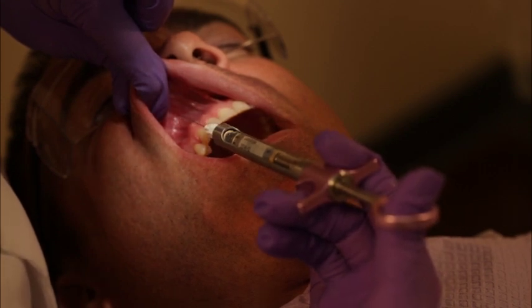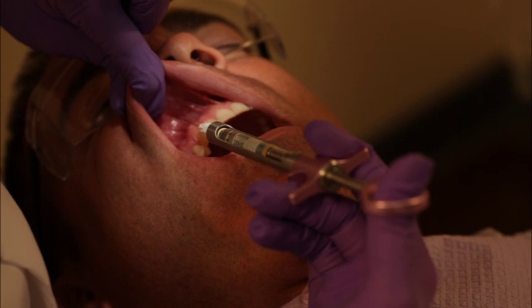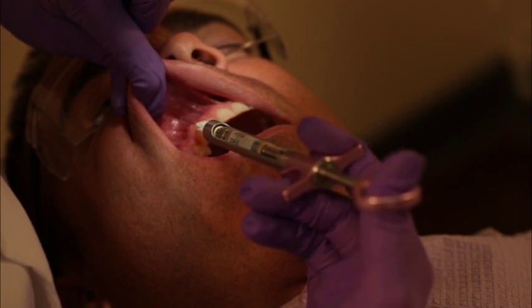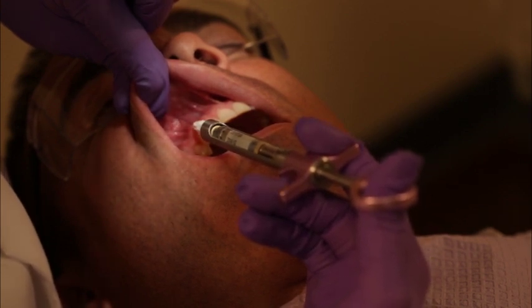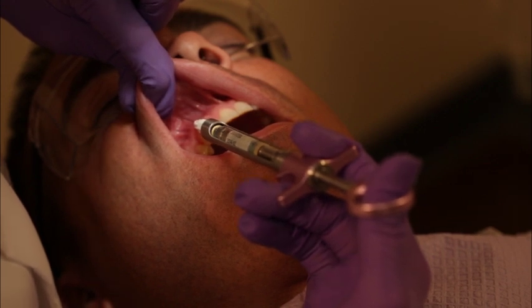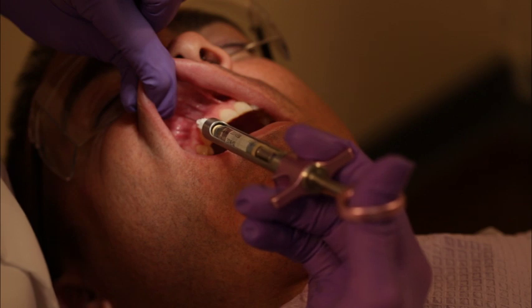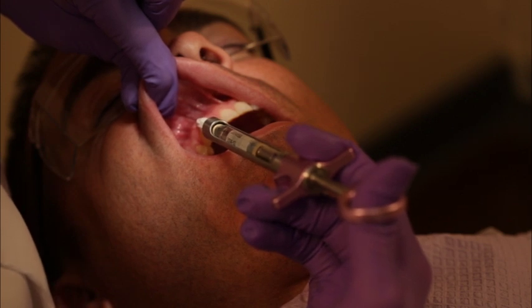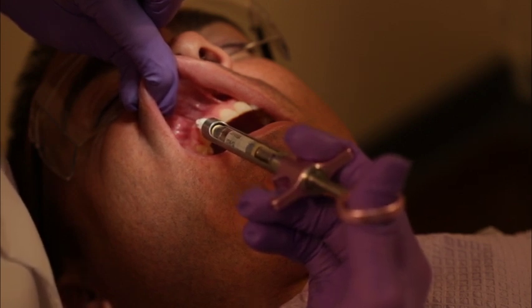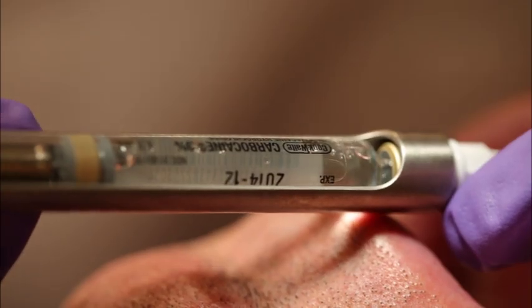Insert the needle at the height of the mucobuccal fold at the apex of the maxillary canine, just anterior to and parallel with the canine eminence, at approximately a 10-degree angle off an imaginary line drawn to the long axis of the tooth, and insert approximately 1/4 the depth of the short needle, approximately 5 millimeters, or until the bevel is slightly superior to the apex of the tooth. You should meet no resistance or bony contact.